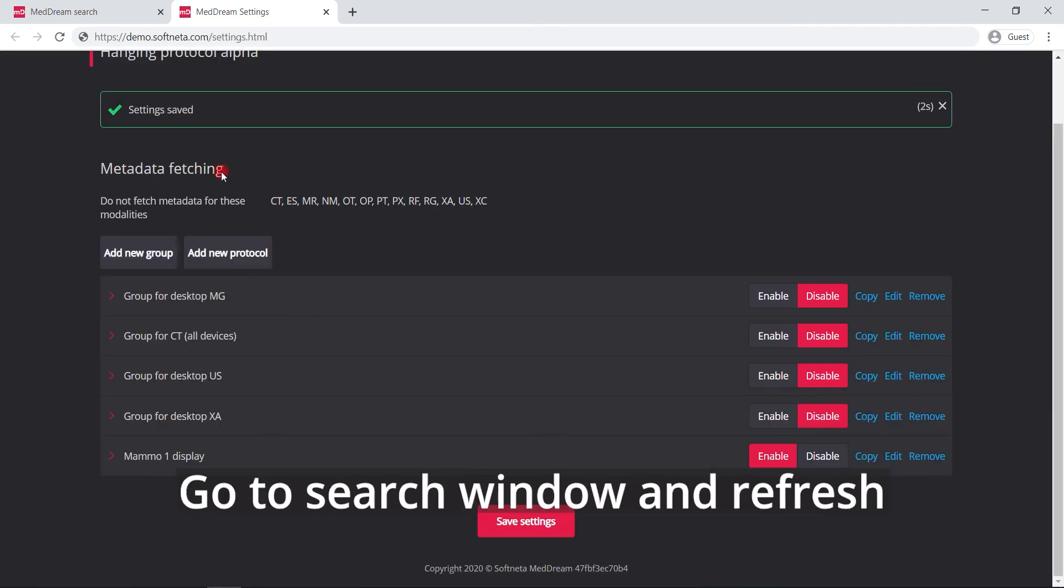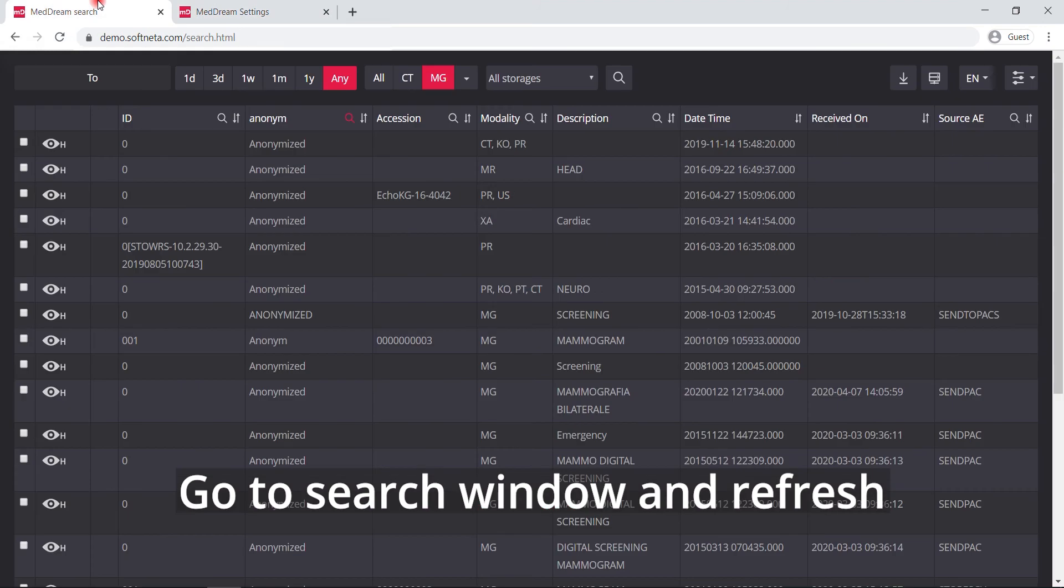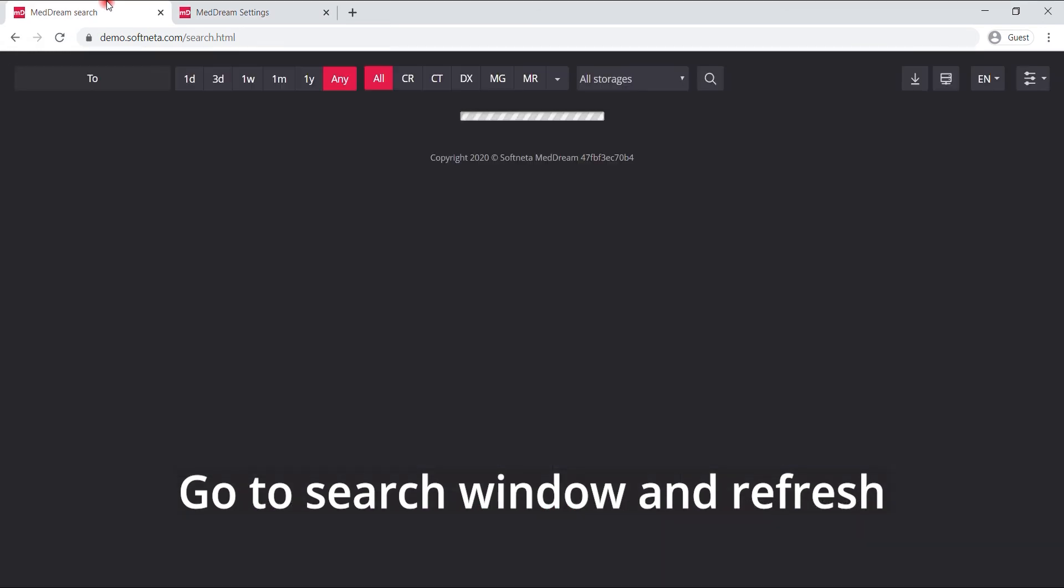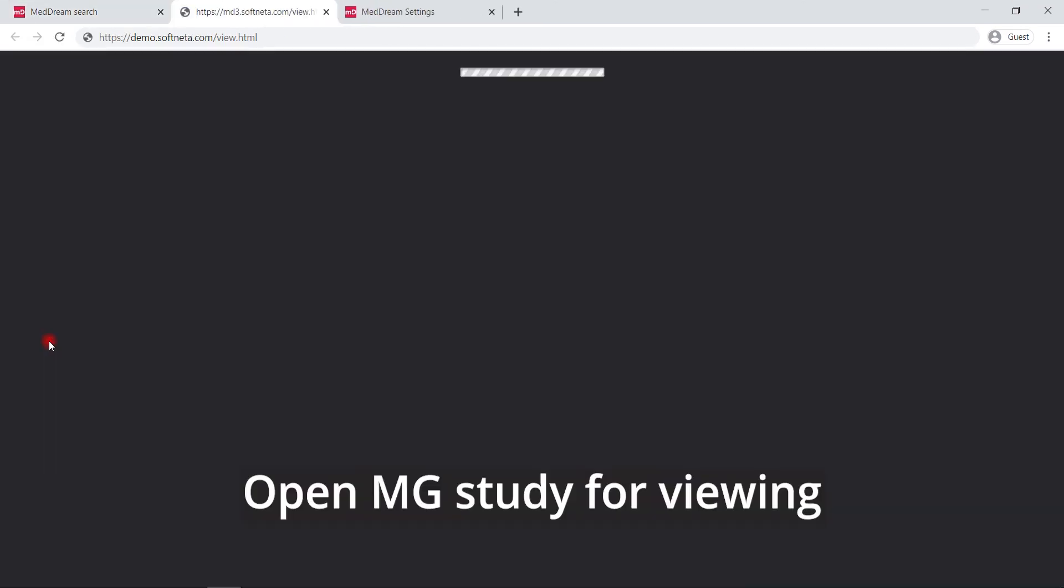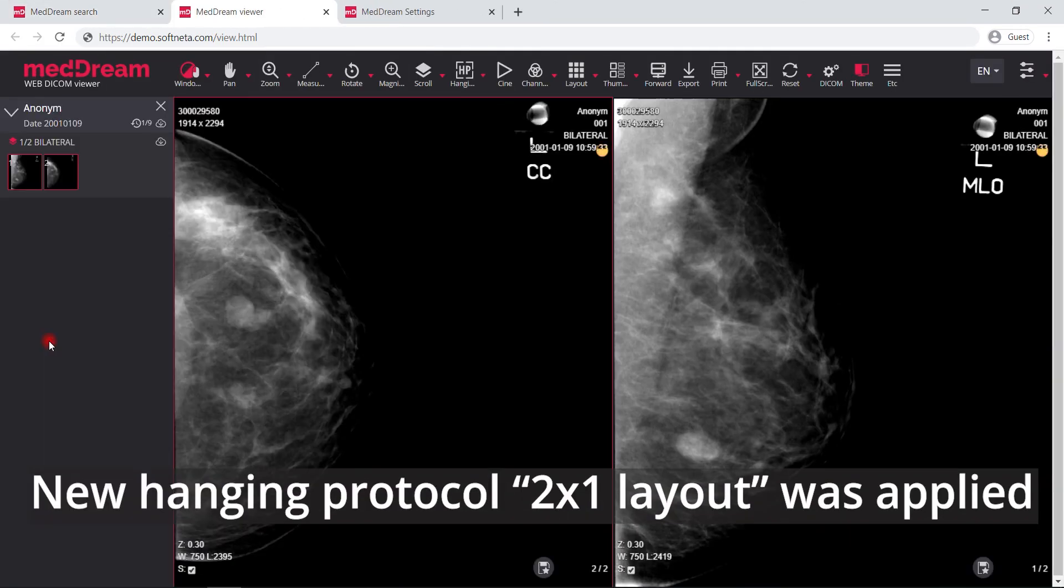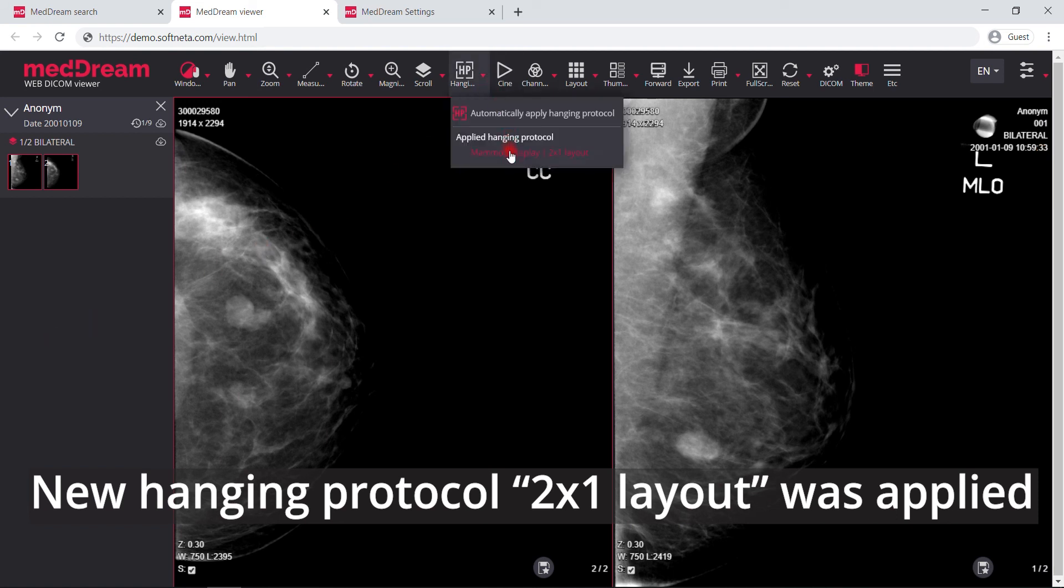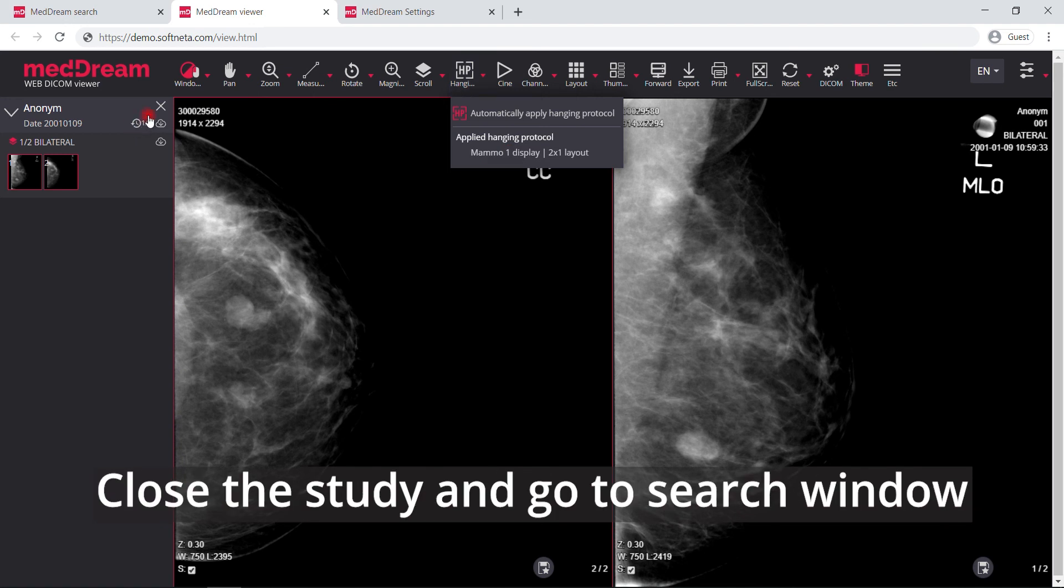Go to the search window and refresh the browser. Choose the mammography study for viewing. As you can see 2 by 1 layout hanging protocol was applied, because this study has two instances.